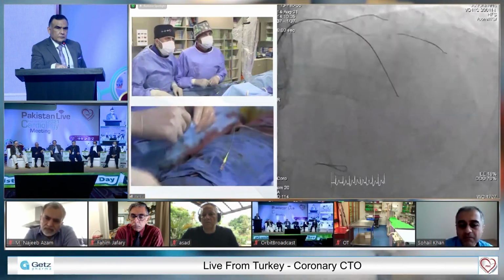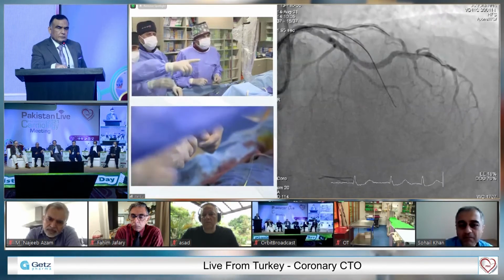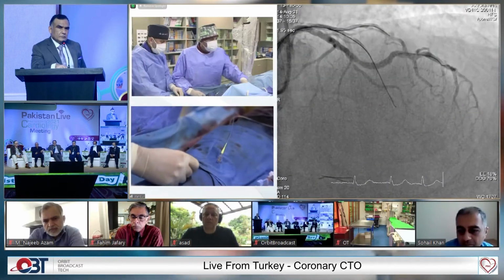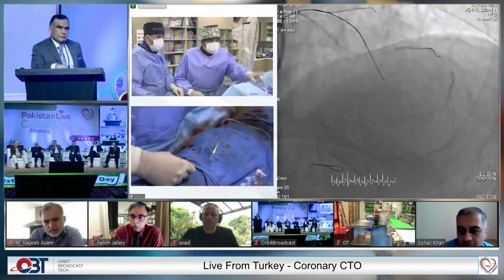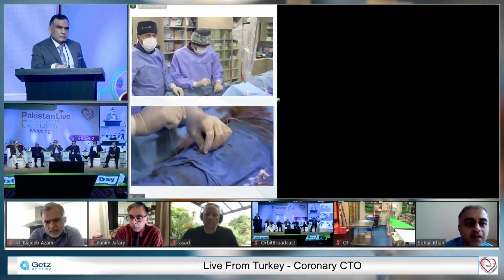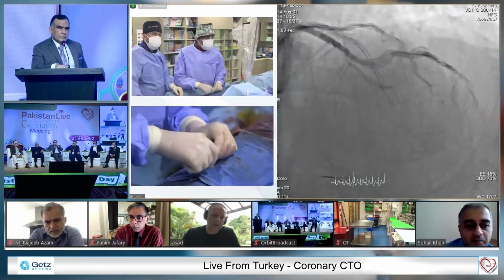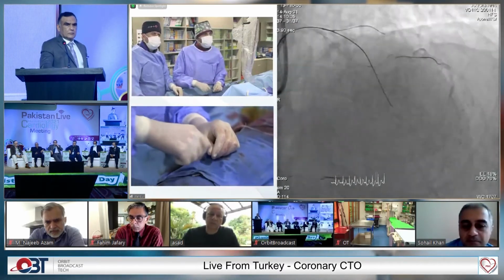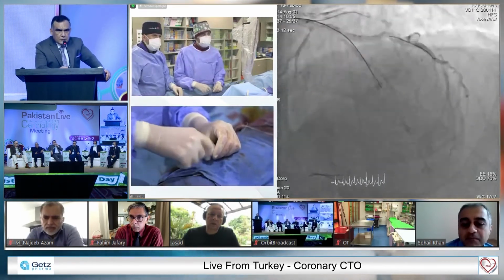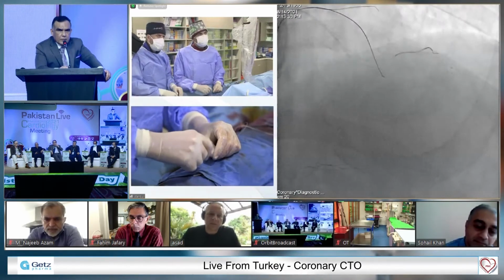Looks like, I'm not sure. Let's see. Yeah, looks like the second one. In here, do you see here, guys? No. Show them. It looks like it's the lower one, not the top one, isn't it? Yes. Have you seen it now? Yes. Okay, good. I have a nice collateral.